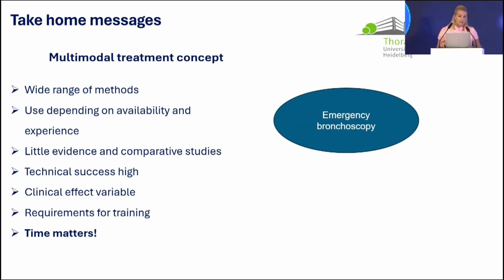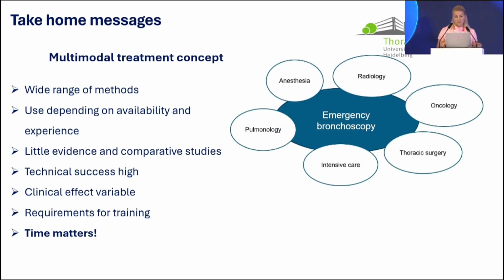The last take-home messages: multimodal treatment concept. This is really, really important. We have a lot of methods for these emergencies. Depending on what your hospital has; we don't have laser, for example, we use APC. Comparative studies are not existing, and it's not ethical to have comparative studies in this. Experience is very important. Think that time matters, and talk to your colleagues in the hospital and work with them together also in an emergency.